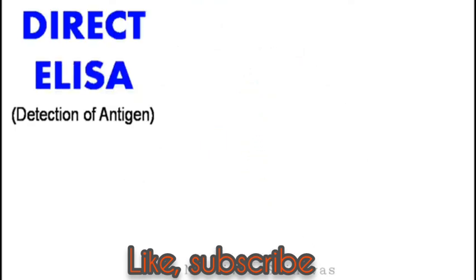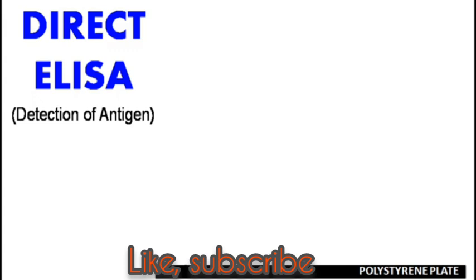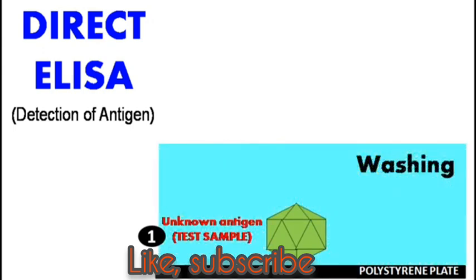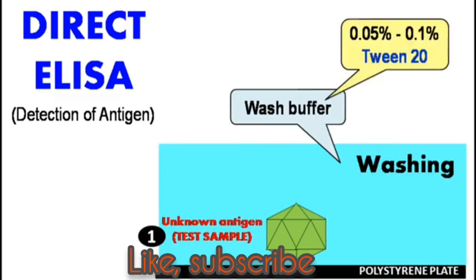Number 1. Direct ELISA, used for the detection of antigen. For conducting ELISA, a polystyrene plate is used. What is special about this polystyrene plate is that it has a very good affinity, or binding property, for any proteins, that is, antigen or antibody. In direct ELISA, the first step is coating of unknown antigen, that is, addition of test sample. Following coating and incubation, washing is done. Between each step, washing is done using wash buffer made up of 0.05% or 0.1% Tween 20.